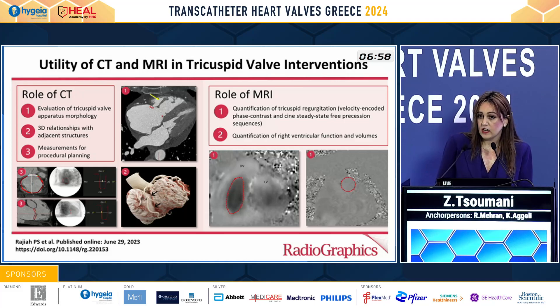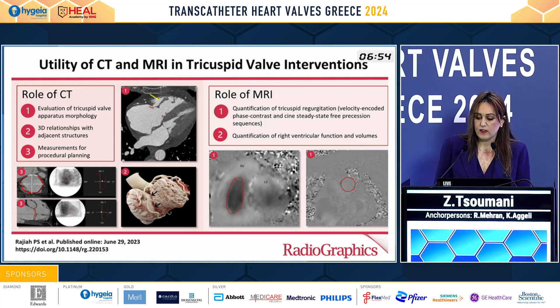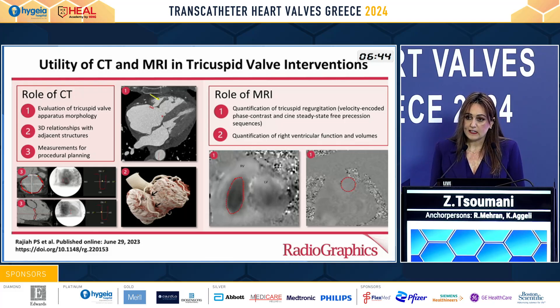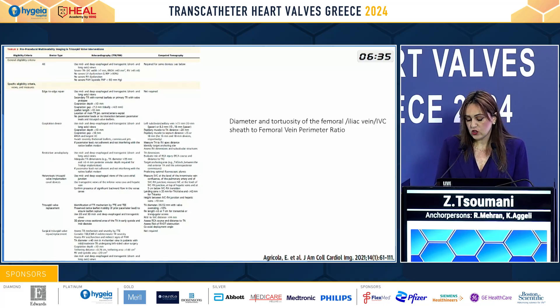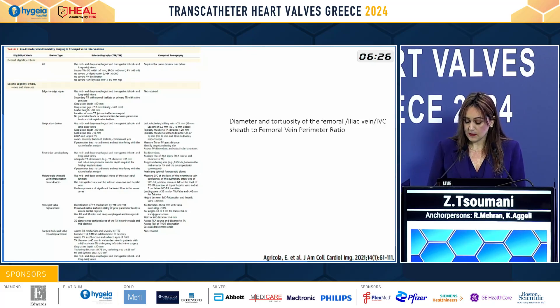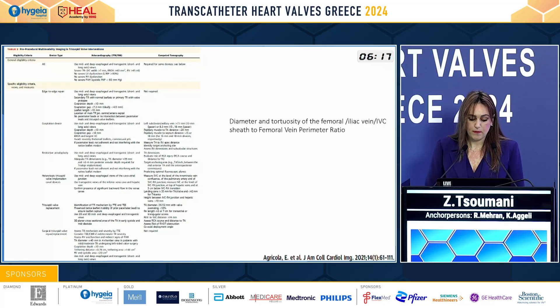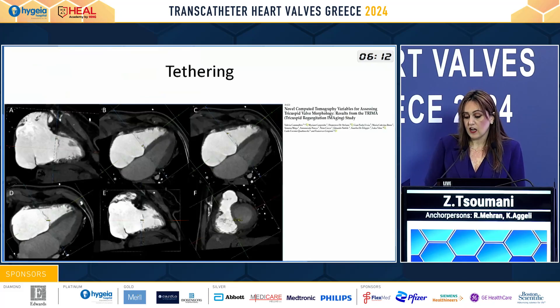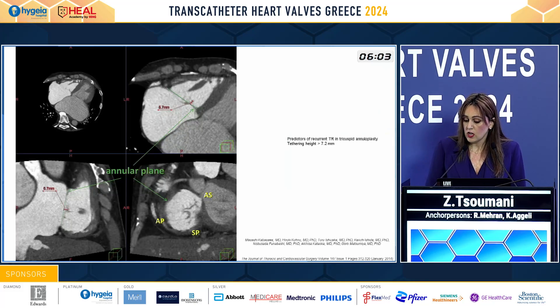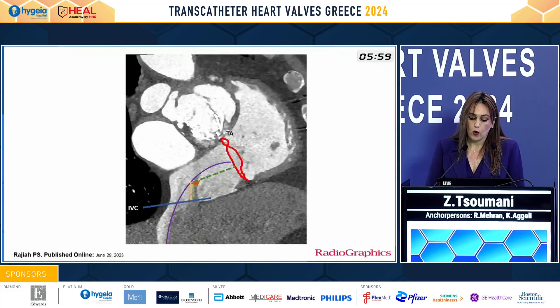In recent years, especially with the evolution of tricuspid valve interventions, cardiac CT has an additional role in selecting appropriate patients for interventions and by providing accurate tricuspid valve sizing. Different interventions require different additional parameters to be measured, as well as the diameter and tortuosity of the femoral, iliac, and IVC veins. Although cardiac CT is not generally recommended for edge-to-edge repair and surgical tricuspid repair or replacement, we can still measure tethering height, area, and angle, giving predictors for residual TR, or help with catheter angulation during the edge-to-edge repair procedure.